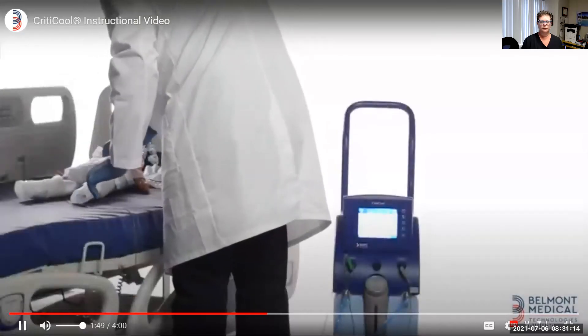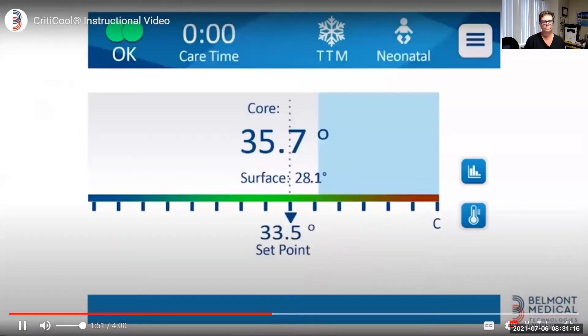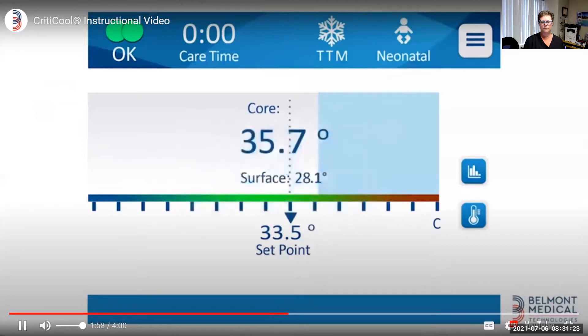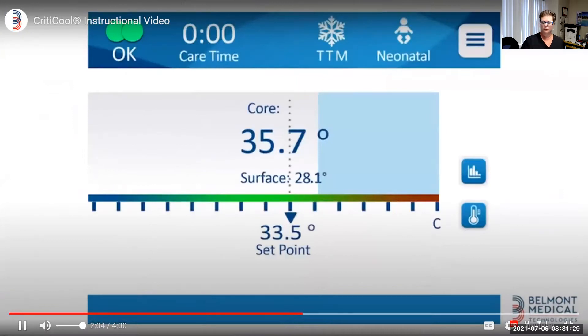Now the machine is set up and running. The default set point for TTM is 33 degrees Celsius for adults and 33.5 degrees Celsius for neonates. These settings may be changed for individual cases. Let's go over the data on the main screen.